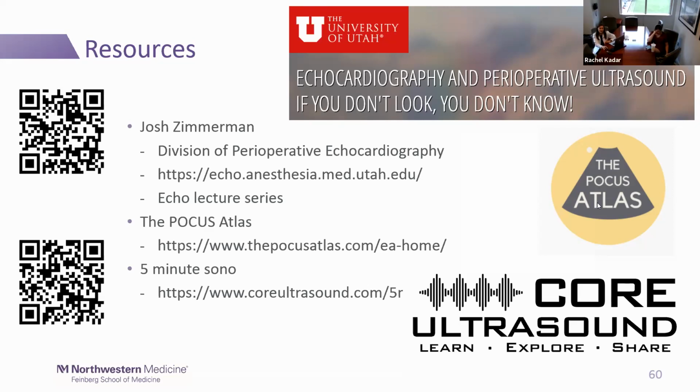That is a great question. As you mentioned, in emergency medicine and especially ICU, we don't really have the ability to turn them in the left lateral, which all the guides say to do. So when I teach people, I make them practice with the patient supine because that's generally how they are. Certainly turning them left lateral does improve my images, but with POCUS, sometimes you're getting what I refer to as a POCUS image where it's not crystal clear.